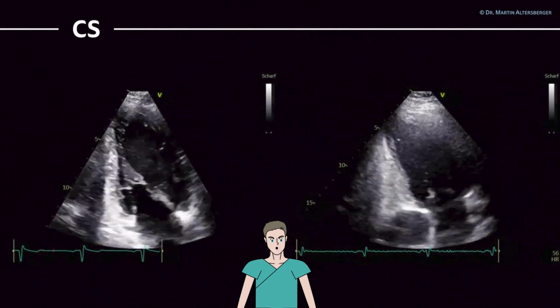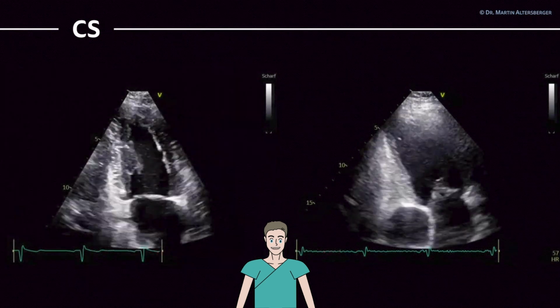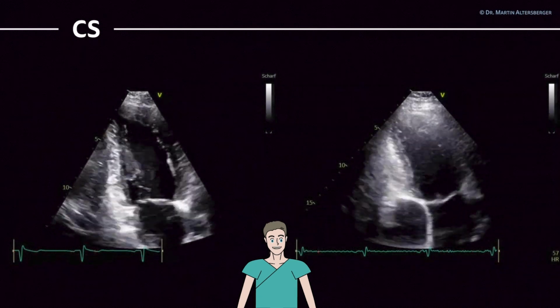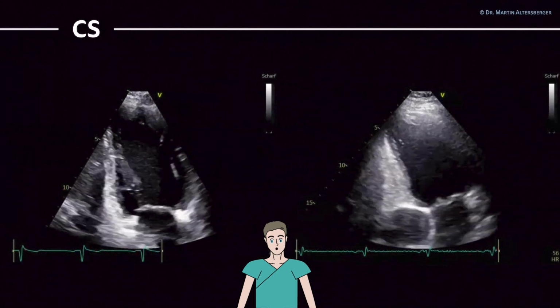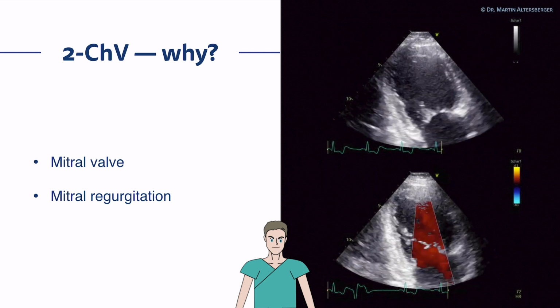Visualizing the coronary sinus view, here you have it very, very subtle, very small. In this case, it's truly an enlarged coronary sinus. This is most likely, in this young patient, due to a persistent left superior vena cava. So many structures you can visualize in only a few angulations and views.